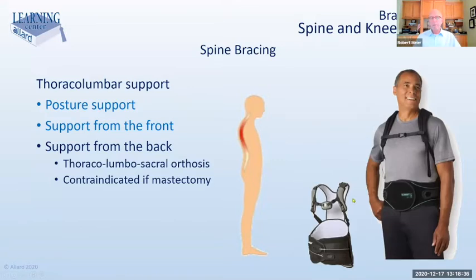This one is probably more user-friendly in my experience. You don't have those two pads pressing on your chest wall trying to hold you up. This one is pulling you up from the back. It's probably a little bit more comfortable, a little bit more user-friendly.